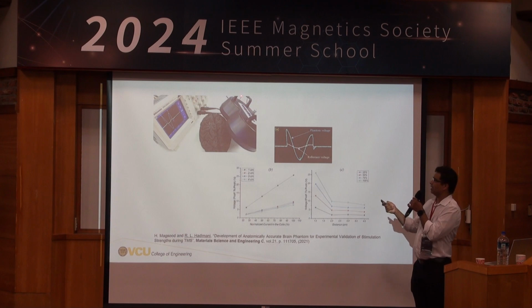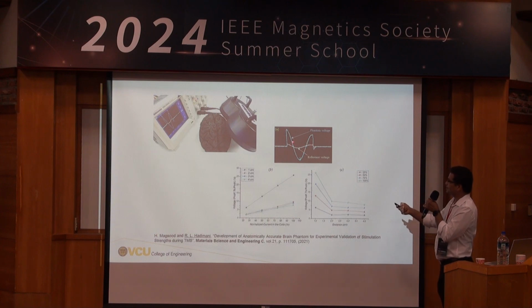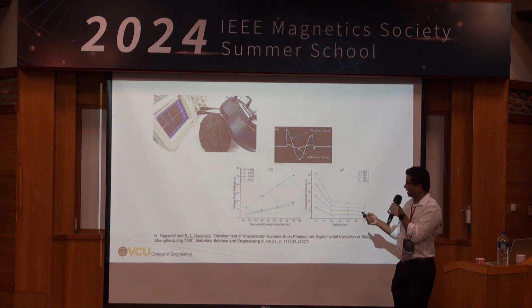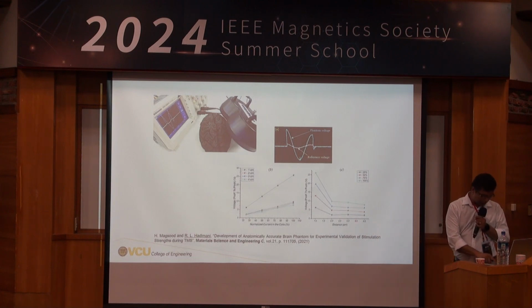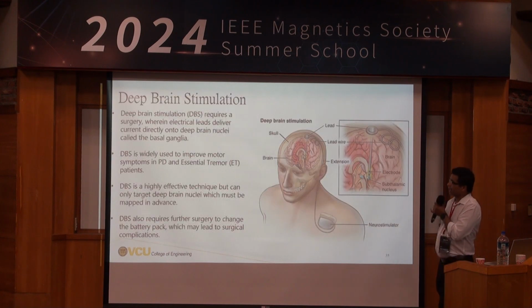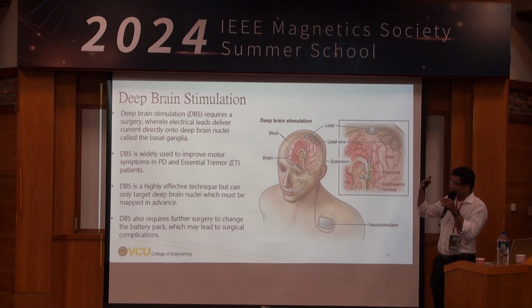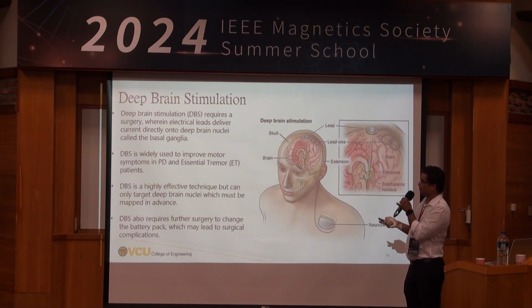So if you just put an electrode, or just a wire, below the TMS coil and measure the voltage, you get this nice, not completely symmetric, but nice waveform. And this is what you find in a phantom. This is a reference if you just put it outside; this is inside a phantom. And we measured the voltages, and it confirms our simulations. So now we have built a brain phantom where we can test stimulation strength in the form of voltage at different levels.